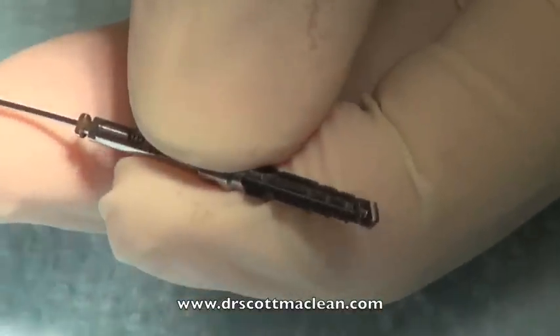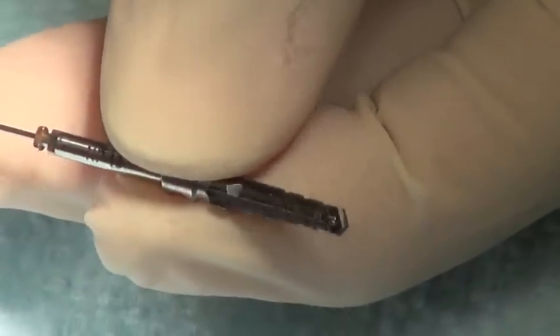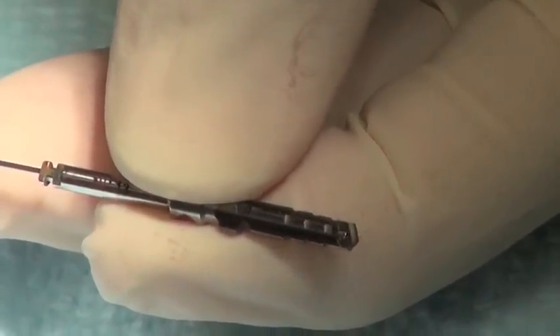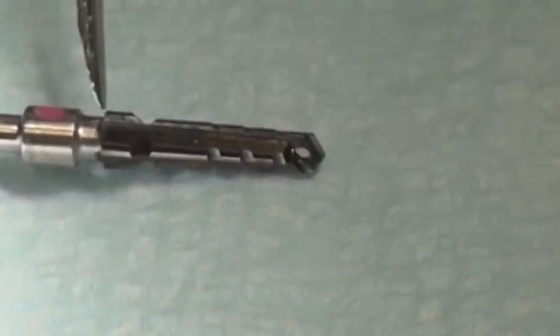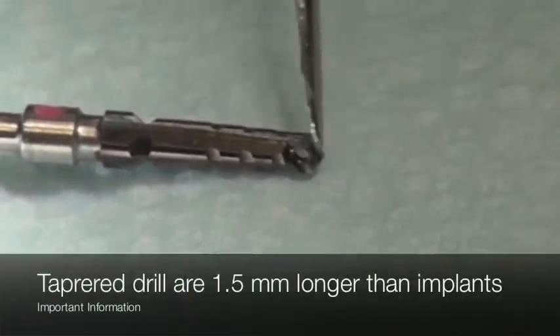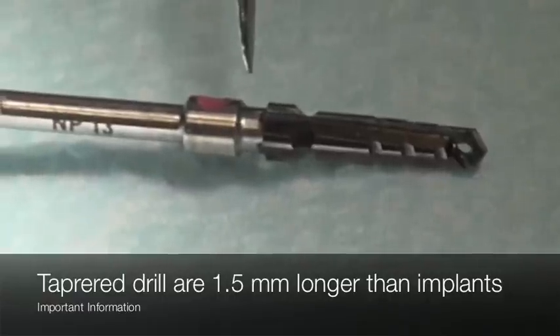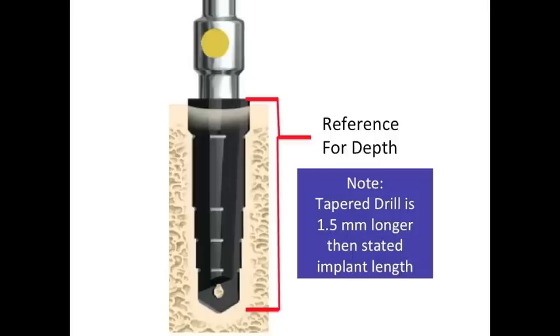Water will be squirted up through a cannula in the middle of the implant drill, and also squirted on the outside to keep it cool. The drill will be inserted to the marked level — not up here, but right here. This length from the tip to that point is actually 1.5mm longer than the stated implant length by the manufacturer. So the implant length is 10mm, and this is going to be 11.5.